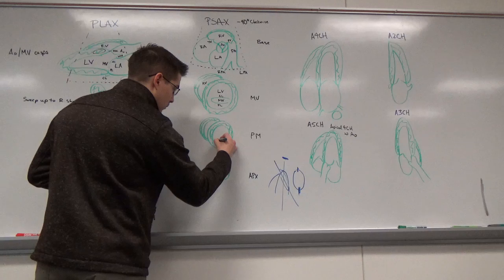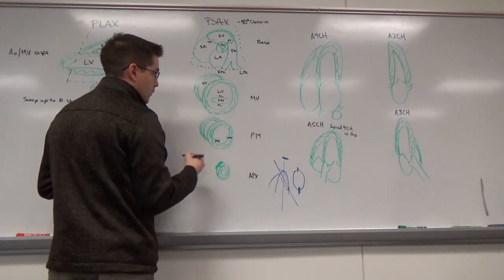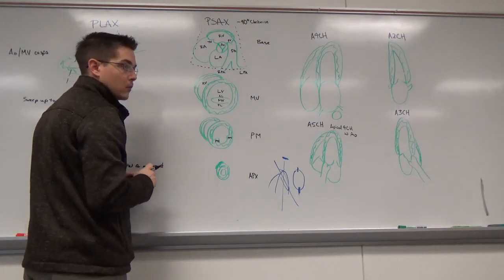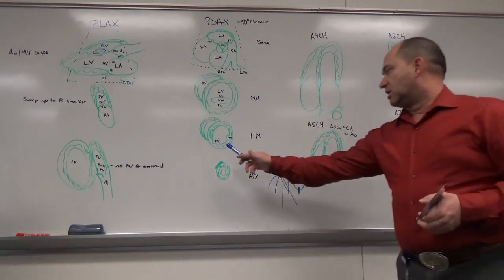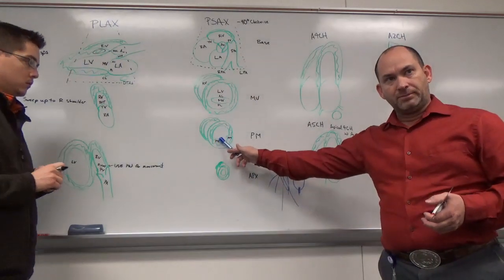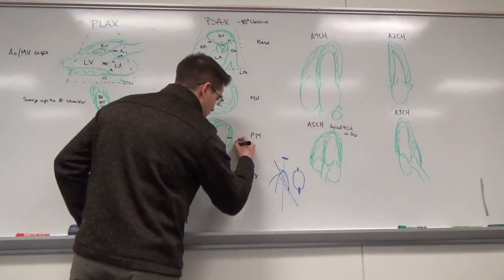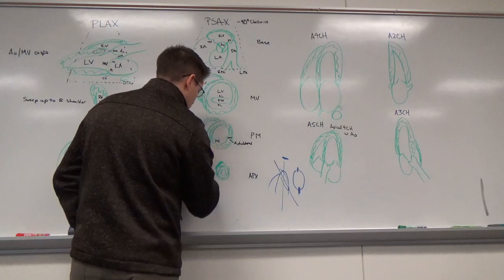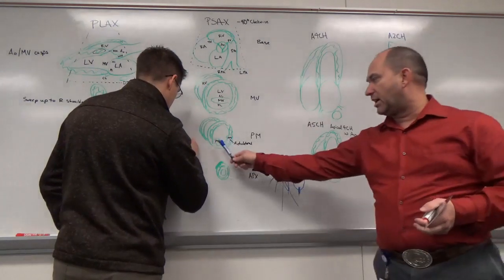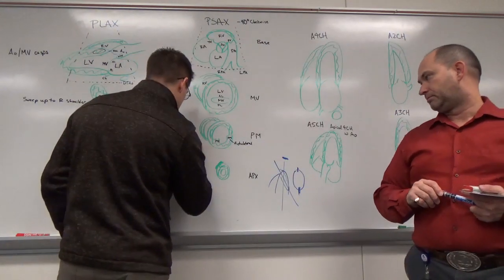We've got papillary muscles. Now we need to specify the specific papillary muscles, because in the left side of the heart they are pretty distinct, whereas on the right side we have three fairly indistinct papillary muscles. So like right and left, or? So this is posteromedial. This is anterolateral. I think in Dennis's slides they actually called it posterolateral, which is what they used to call it. New terminology. So posteromedial is always by the septum. Posteromedial? Posteromedial.